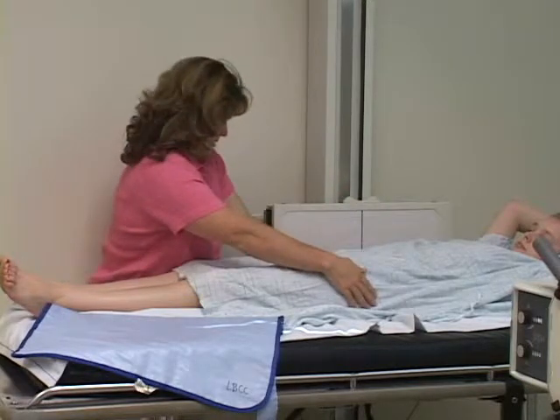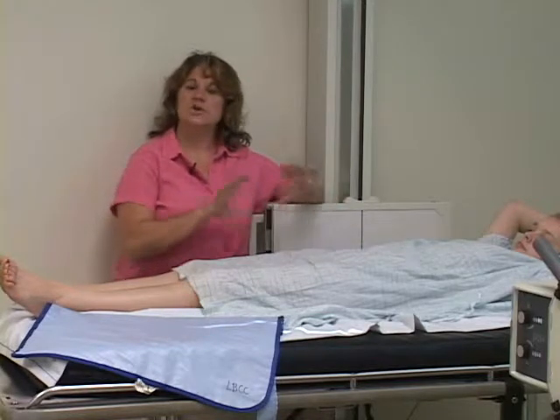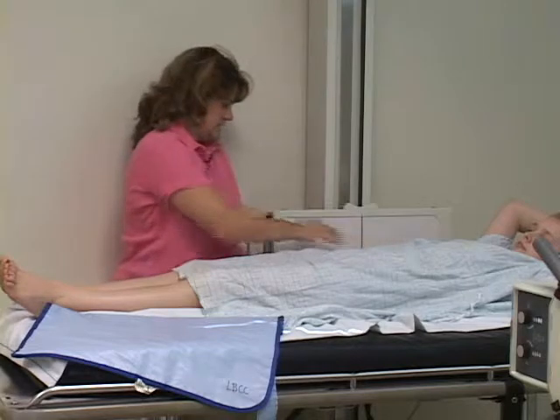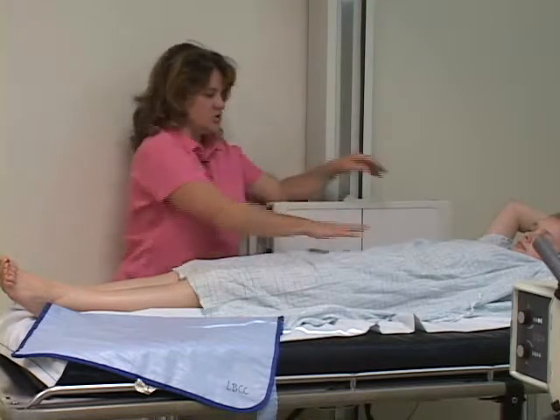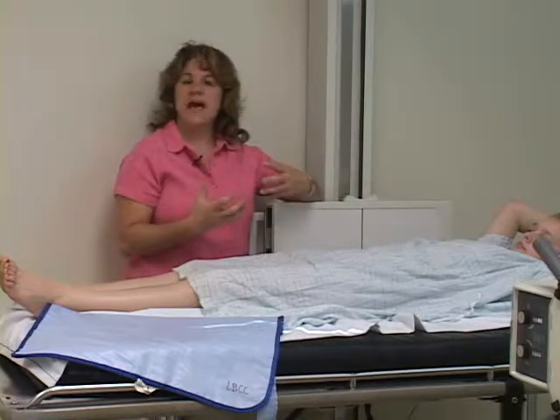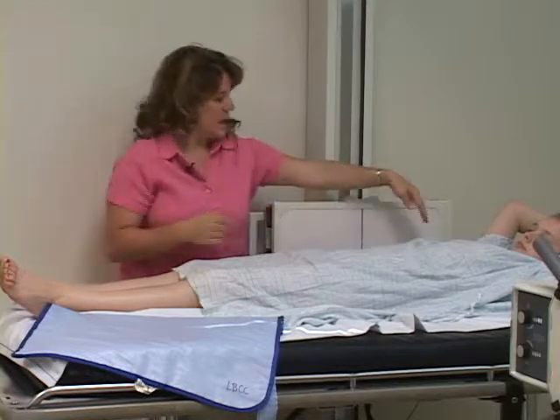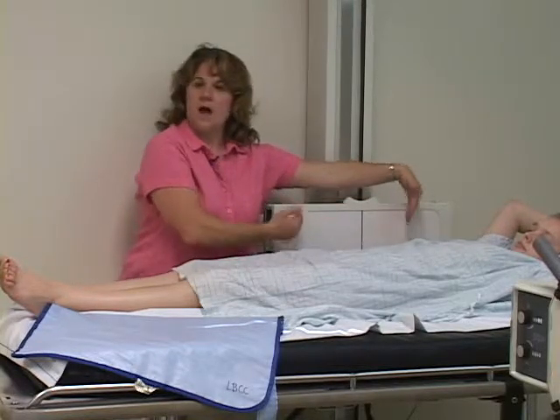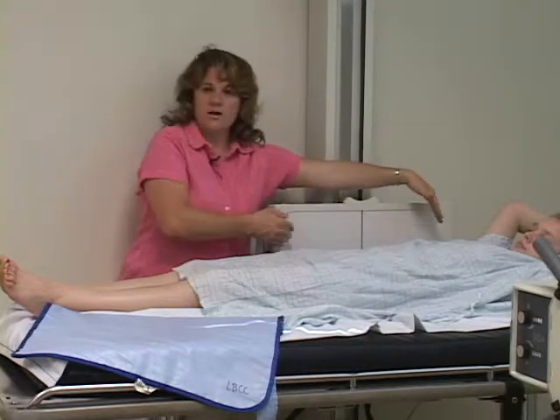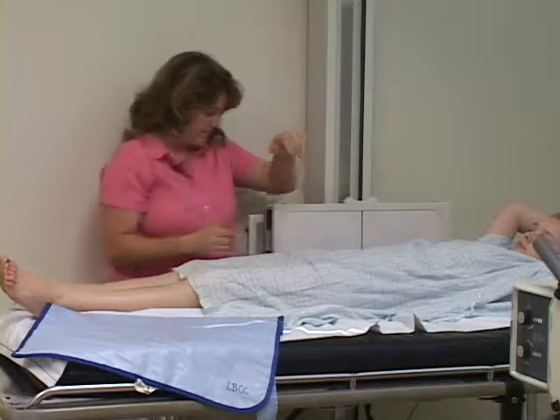Okay. The other important thing about this particular position is that you collimate down as much as you can. You want just enough light so that you're basically skimming the top of the abdomen because there's a lot of scatter involved with this film. So the more collimation that you can do, the better. And then you don't want to collimate off of your IR. So you're just covering your IR from this side to this side, but you're collimating down this way.